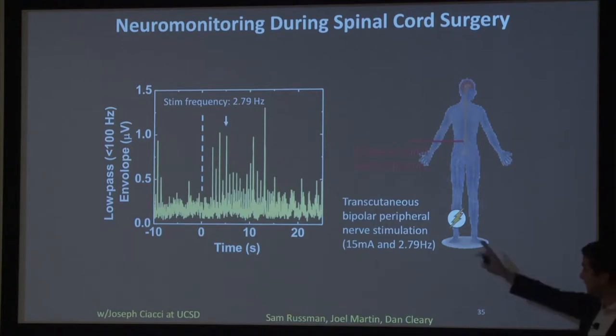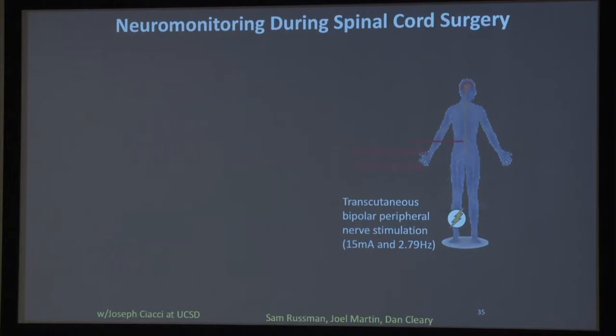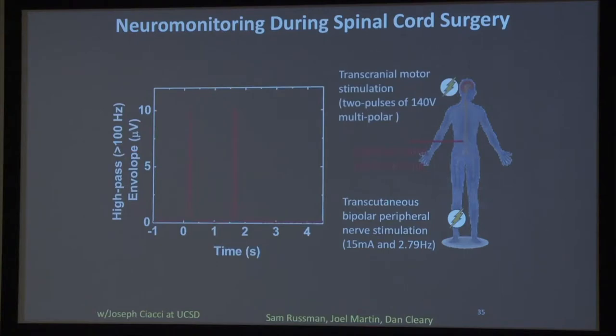What the significance of these results is that with clinical stimulation, typically one needs about 16 milliamps or so to induce activity and record it with the strip electrodes, but with the thin flexible electrodes, we can do that with about 2 milliamps. And the same is true for the cortical stimulation.